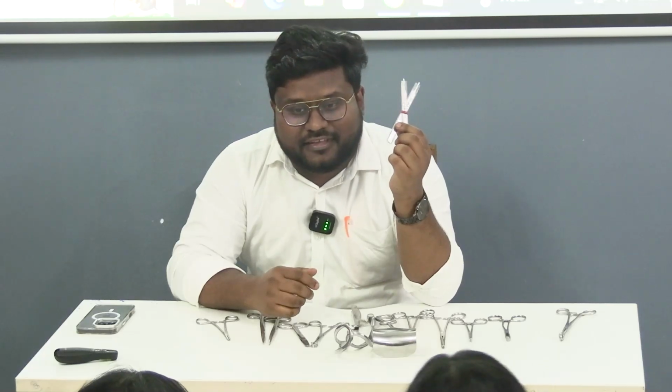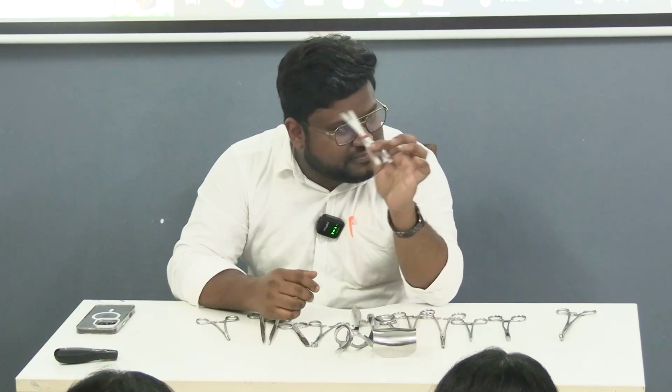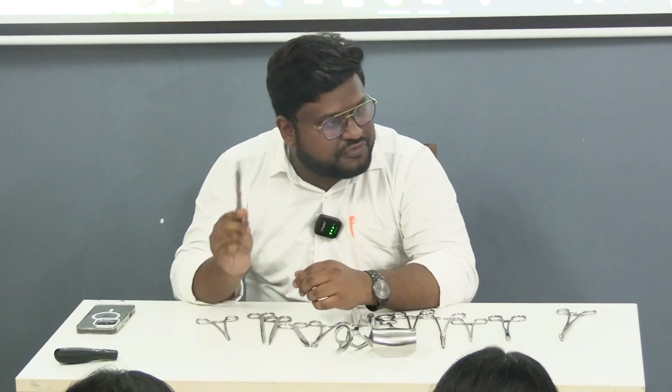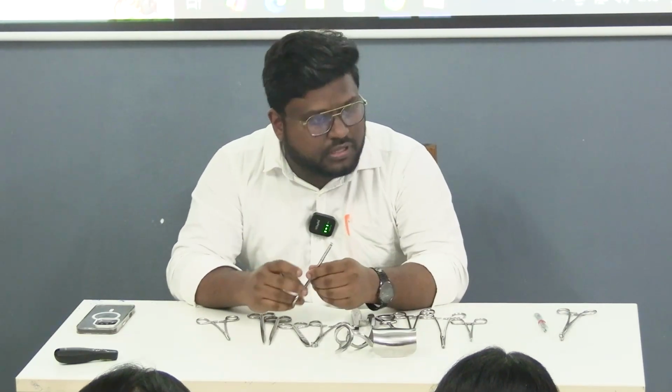হ্যাঁ, তাকে কি বলে? বার্ড পার্কারস হ্যান্ডেল, বিপি হ্যান্ডেল, বার্ড পার্কারস হ্যান্ডেল। ঠিক আছে, এর উপরে স্ক্যালপেল ব্লেড অ্যাটাচ হবে। This is used for giving the incision. We talked about the incision already. নেক্সট আমাদের কি কি লাগবে?